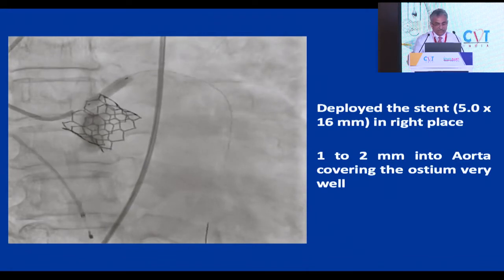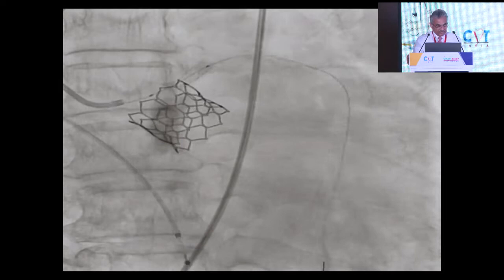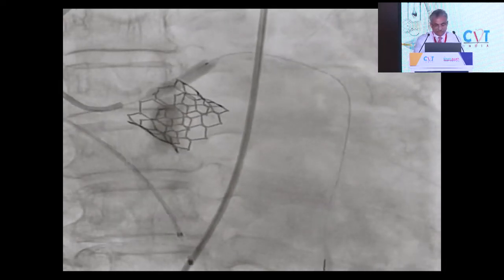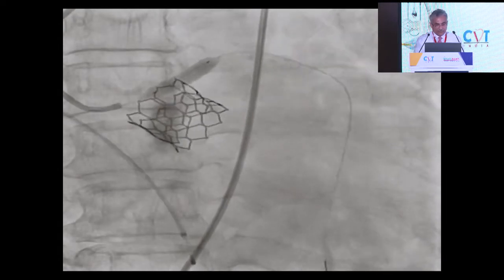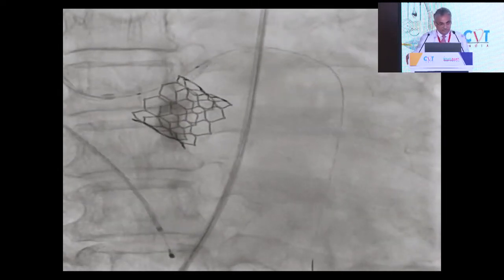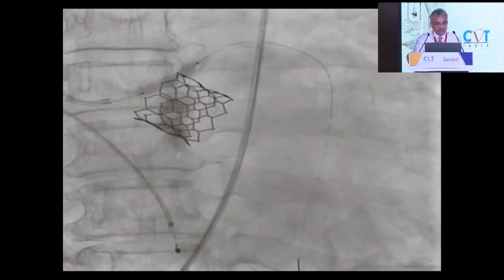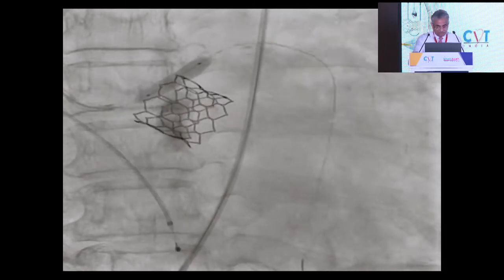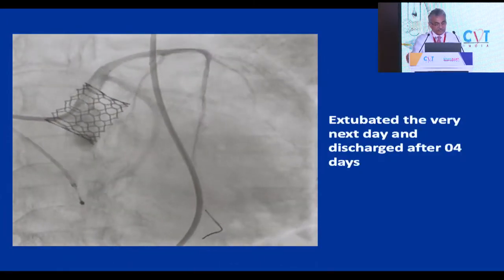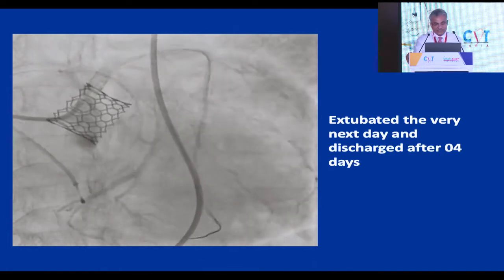We came slightly back so that now we are into the aorta and the distal part is safe. We went on high pressures and deployed it further, better. Came further back, went to about 18 or 20 atmospheres, so that it makes it very big. By this time the patient was very stable. And that was the end result. The coronary is flowing fine. And the patient was extubated the very next day and discharged after 4 days.